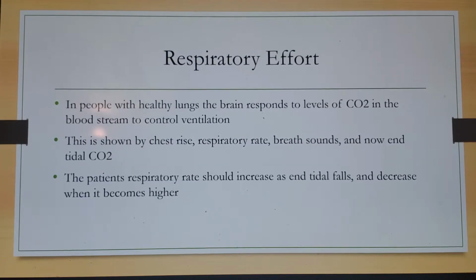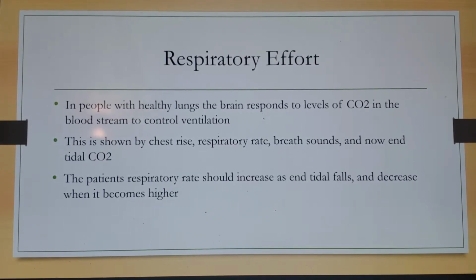Also shows you respiratory effort. In people with healthy lungs, the brain responds to levels of CO2 in the bloodstream to control ventilation. That's the whole process behind not wanting to give some COPD patient too much oxygen and knock out their respiratory drive. So shown by chest rise, respiratory rate, and breath sounds. Those are previously some of the things we use to assess a patient's respiratory effort. But now end-tidal CO2 can give us a lot of that same information. The patient's respiratory rate should increase as their end-tidal falls and decrease when it becomes higher in a normal physiologic and mental status state.